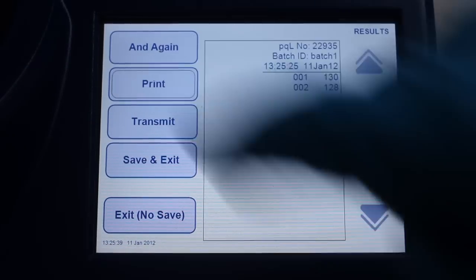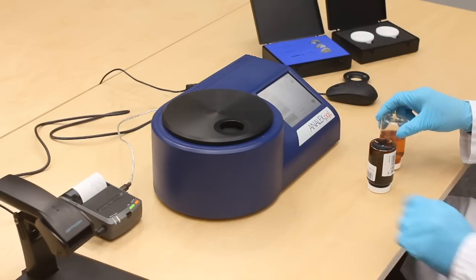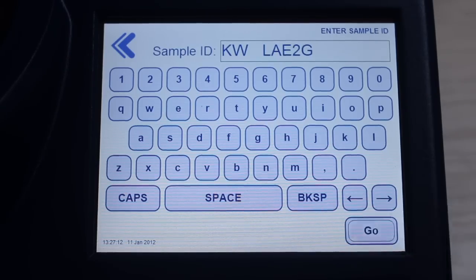Accessories available include printers for generating hard copies of results for filing purposes, adapters for different size sample pots, and barcode scanners for simple batch data entry.